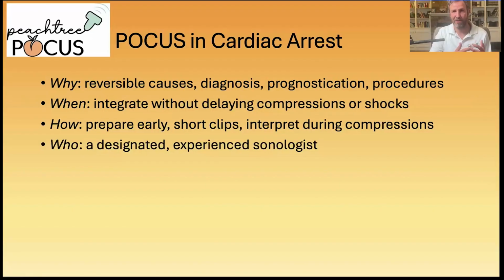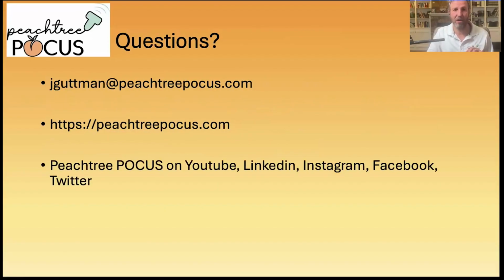POCUS won't replace the fundamentals of cardiac arrest management. Chest compressions and defibrillations still save lives and are the core of cardiac arrest management. When it's used the right way, ultrasound gives us real-time information that can guide resuscitation and potentially reveal reversible causes. And really, it can change the entire course of the code. I'll stop here so we can open it up.